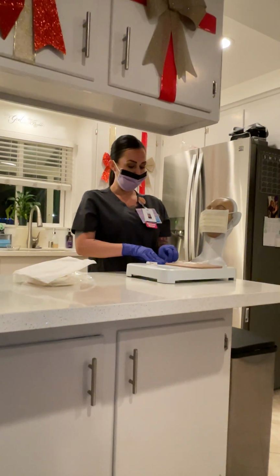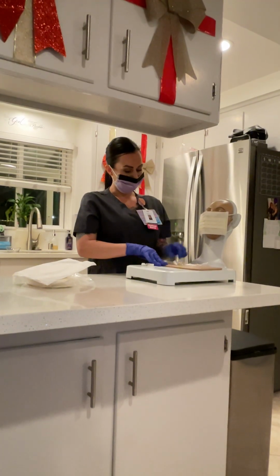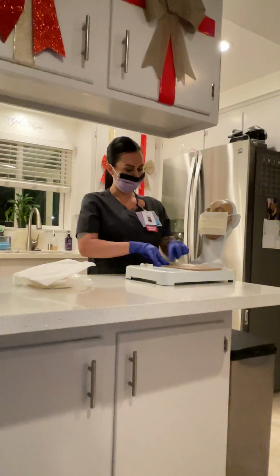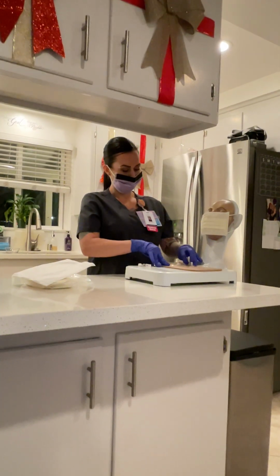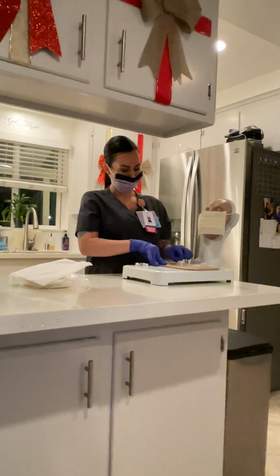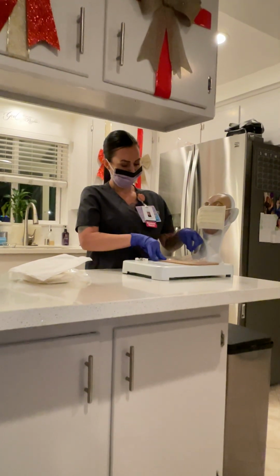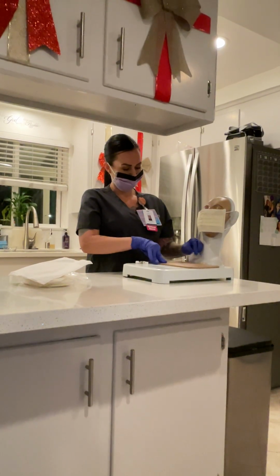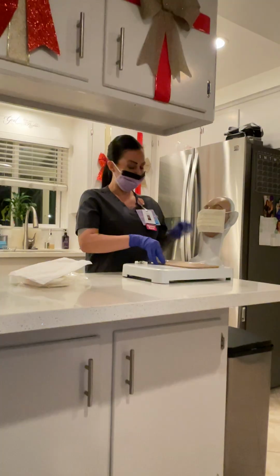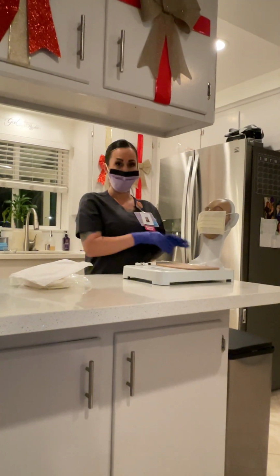And we want to pull away from the insertion site, and this is so that we don't pull out our catheter. That has been removed, and we are going to discard our old dressing now into the garbage.